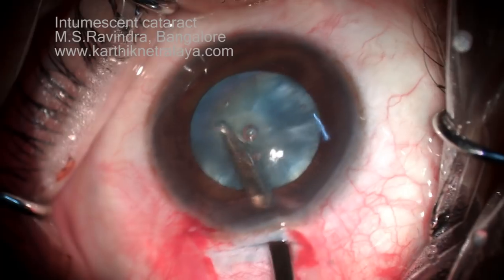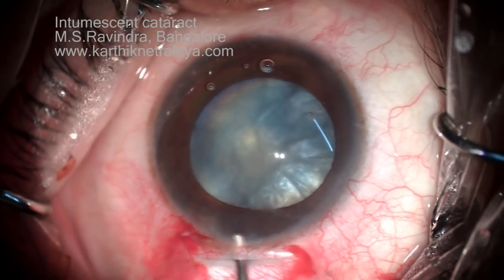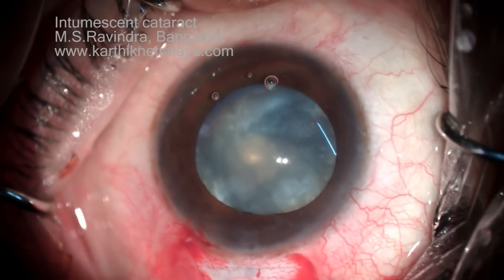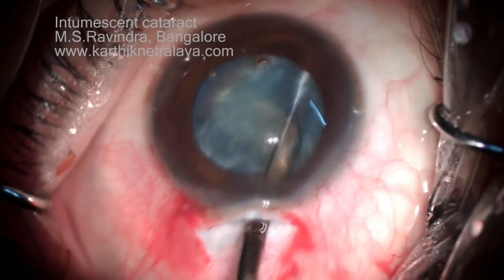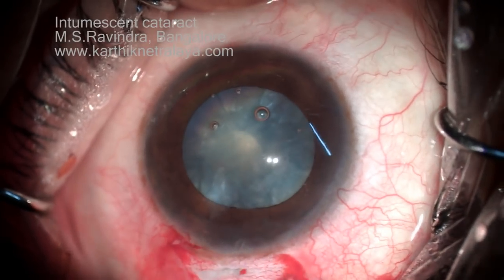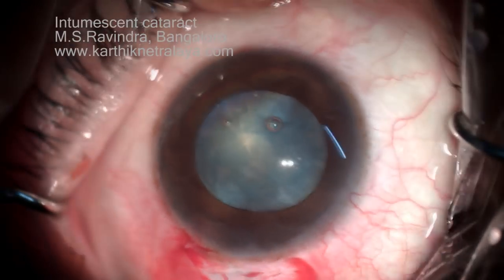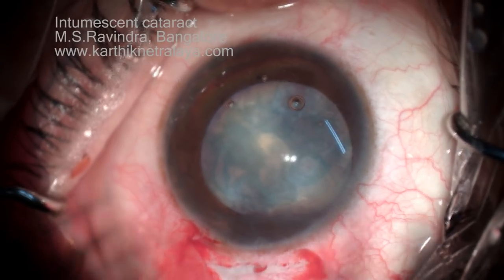Go up to the equatorial area without tearing the rhexis. You should be very careful at the rhexis margin not to induce any tear and allow it to extend to the periphery. The left half of the cortex is clear but the right half still has a lot of cortical material. Bring it to the axis of your Sinsky hook — now more and more cortex is coming in. This will reduce the intracapsular tension and prevent runoff of the capsule to the periphery when tearing it with the Utrata forceps. That's adequate emptying of the capsular bag.